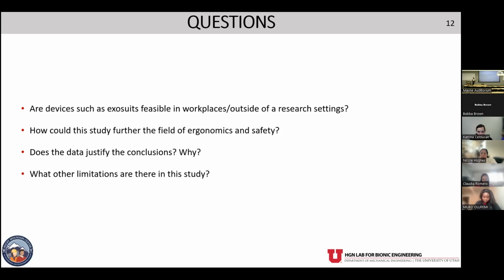Yeah. Having had experience with exoskeletons, tuning is one of the hardest parts of it because everyone responds differently. I work with stroke patients, and that's a whole other ballgame in terms of variability. But there's definitely a plateau period, and there's also an adaptation period. As people have worn it more and are more used to it, you can give them more assistance because they can deal with it. But otherwise, if you start them off too strong, they just fight it the entire time.